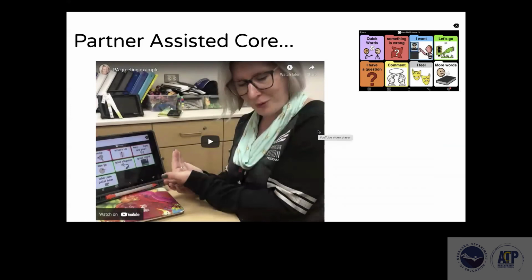The particular student we're talking about in this video, his yes response is huh. And then he also will shake his head for no. So our vision teacher here is going to explain it, and I'm on the other end pretending that I'm the student.